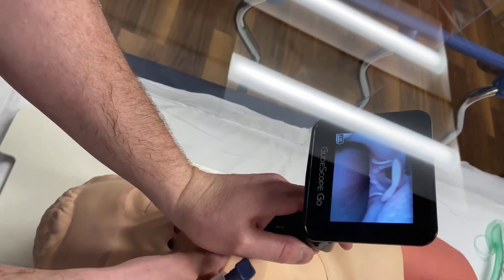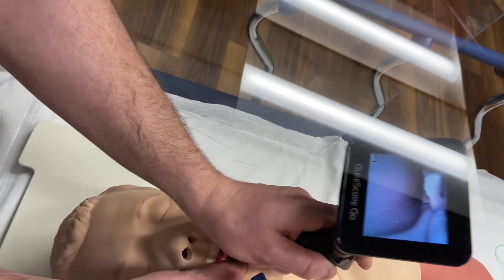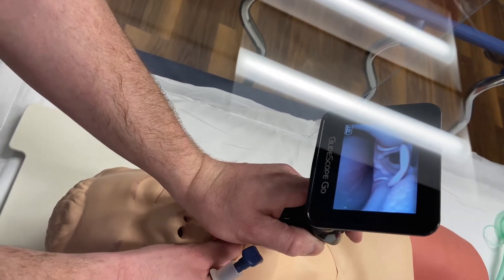Then you focus on getting the best view. Obtain the best glottic view — you can see the epiglottis and the cords there.